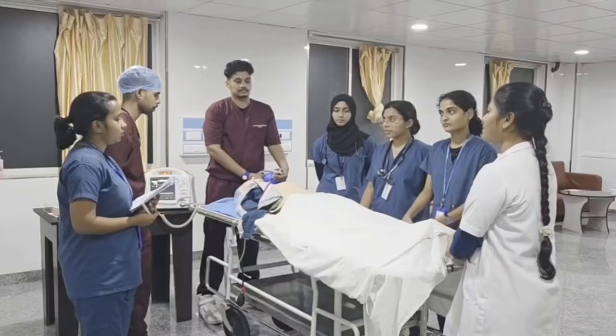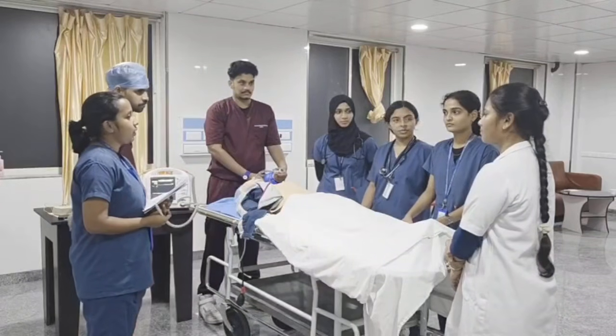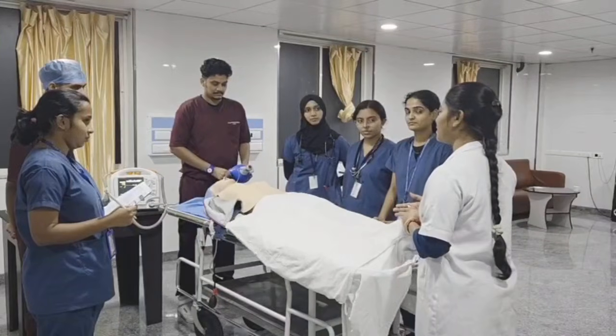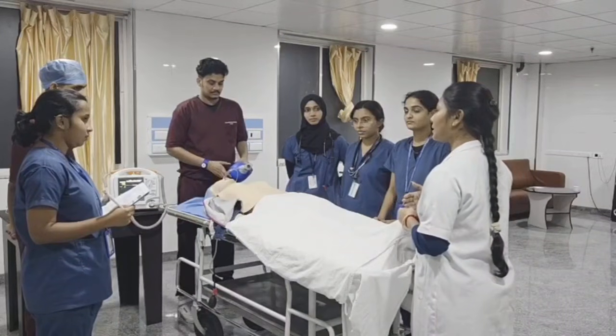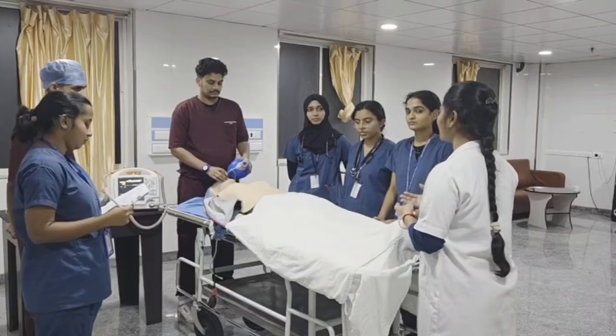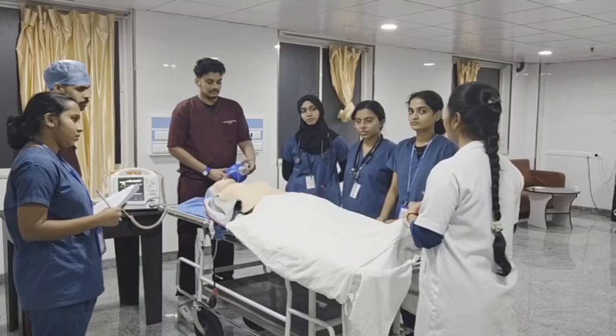Could you take a 12 lead ECG? The 12 lead ECG. You're able to see ST segment elevation. As the 12 lead is showing STEMI changes, so it might be an ST elevation myocardial infarction. We can consider now getting a cardiac consultation and considering a coronary intervention.